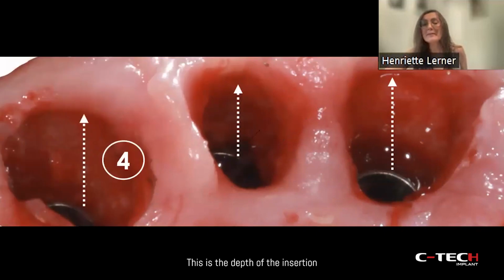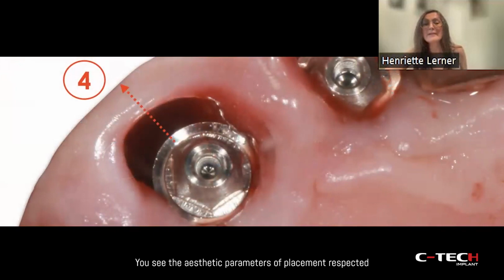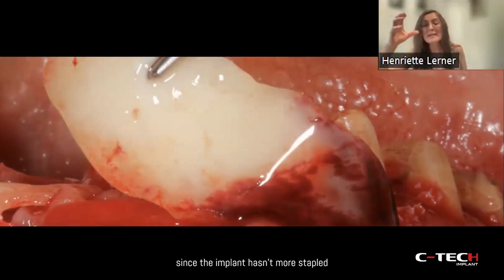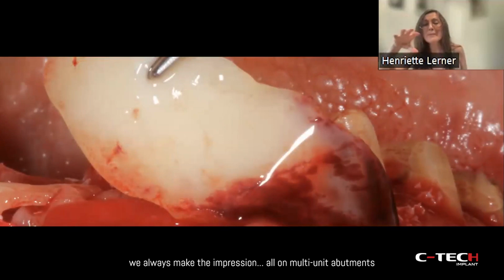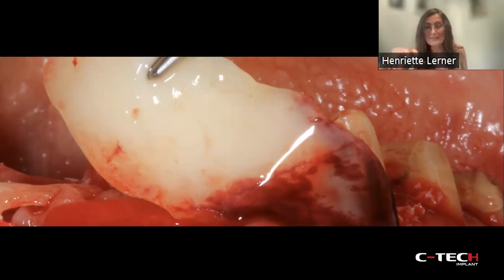This is the depth of the insertion. You see the aesthetic parameters of placement respected also in this case. And the multi-unit abutments. Since the implant has a more tapered conical connection, we always make the impression on multi-unit abutments in order to fix that and not to have any vertical discrepancies.